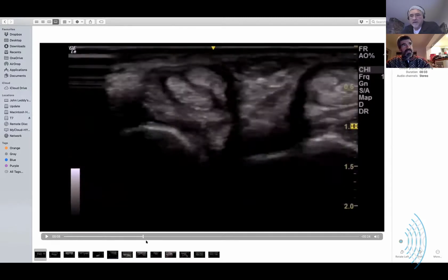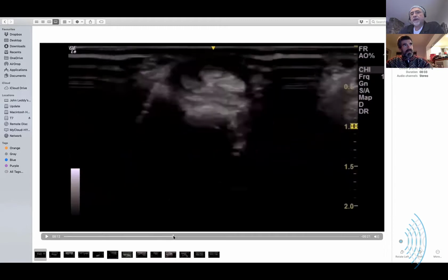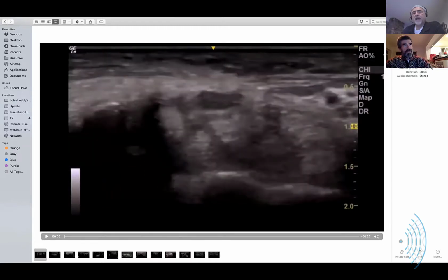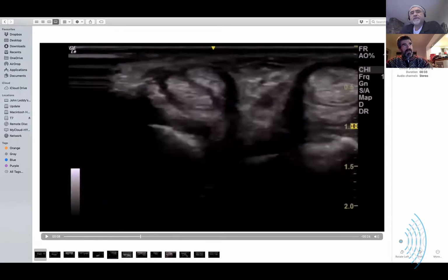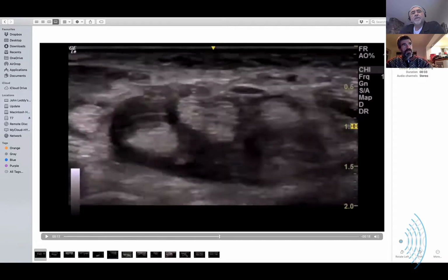Okay. This is wild. It's going all the way down the fingers. If I'm not mistaken, you went all the way from above the transcarpal ligament through the hand and then down one of the fingers. Yes, I'm just following it through. Wow.